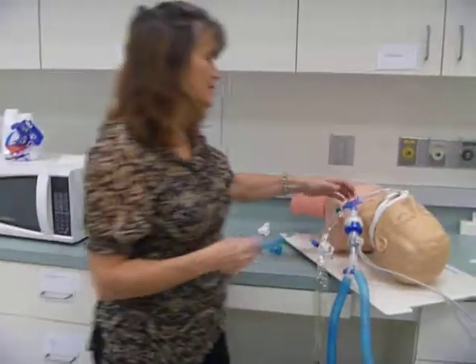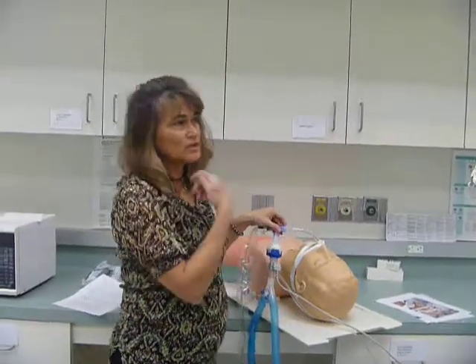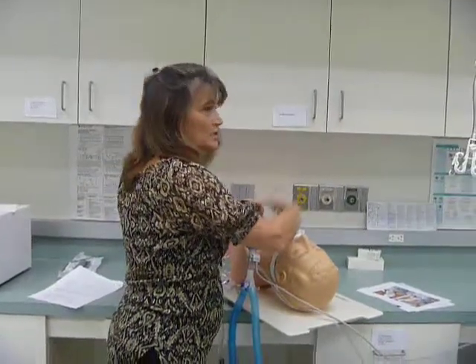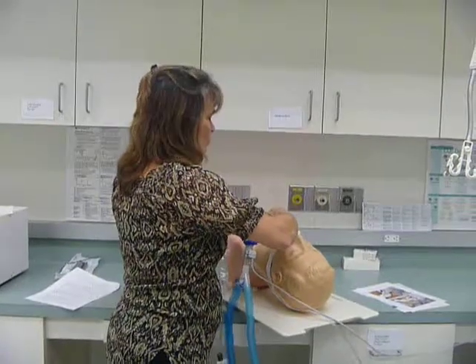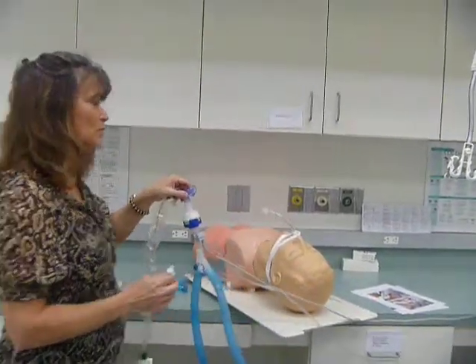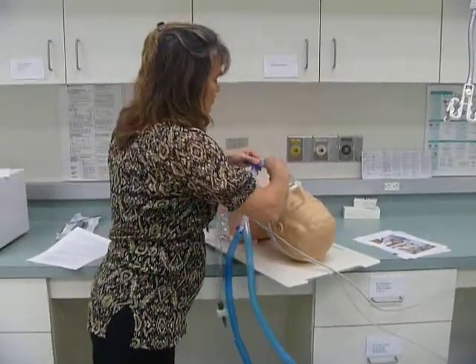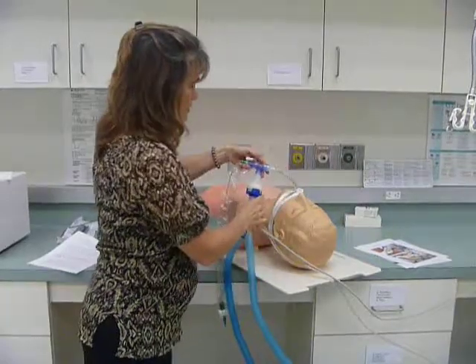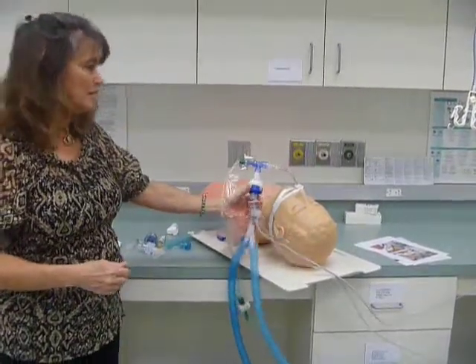So when you're disconnecting, you want to move the endo tube as little as possible because it's just uncomfortable for the patient. So you support the endo tube with one hand, and then you wiggle this off with your other hand. So it takes like a little wiggle to pull it off. When you're putting it on, it's a push and a twist. And for this adapter, it seems like you have to do a pretty good twist to make it stay on.